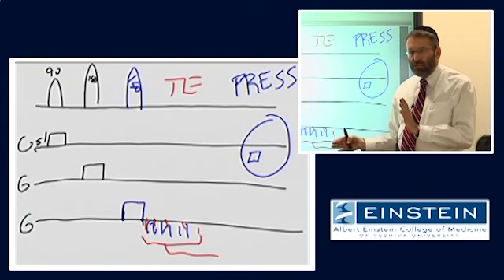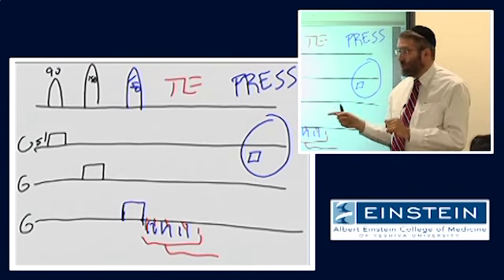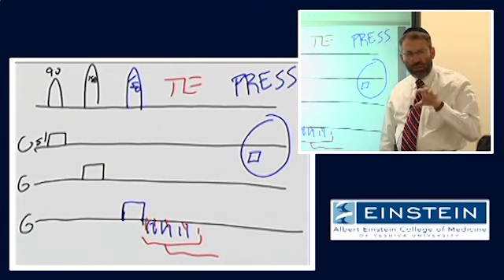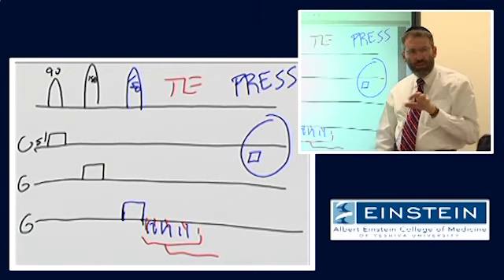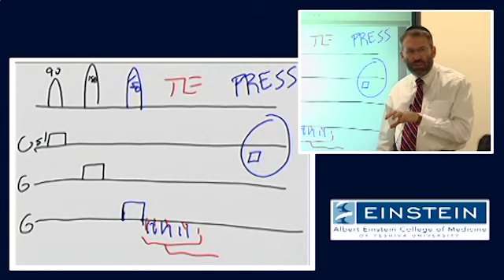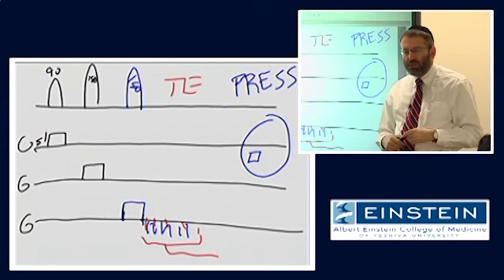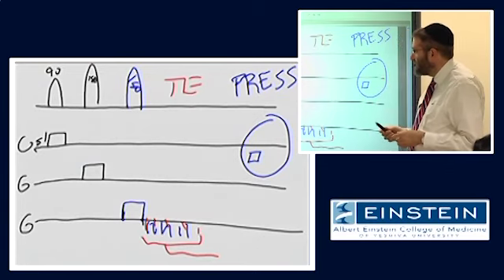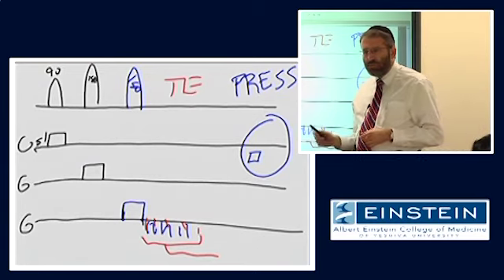So now we're already making some progress. We can now do this multiple times, placing the voxel, which is the intersection of those three RF pulses, at different locations in the brain, and make some comparisons between those locations. Now, is it possible for us to actually do a little bit better than this?